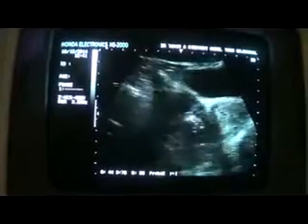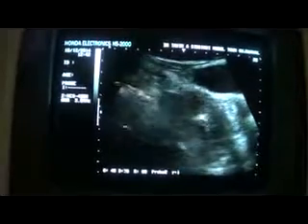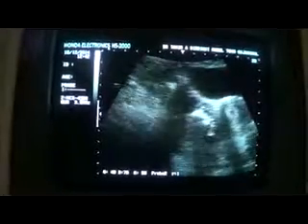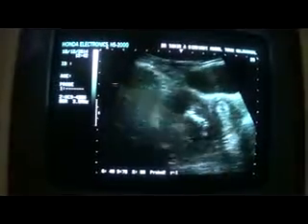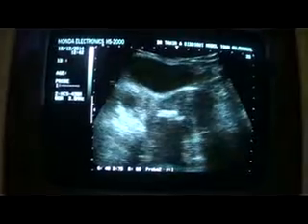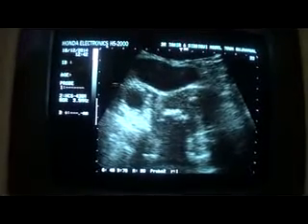Now, when I move the probe a bit inferiorly, I see a solid echogenic area protruding posteriorly, inferiorly from the posterior wall of the myometrium, which is now the transverse section. This is a more clear view. This is the uterus, the fundus. This is the endometrial canal.